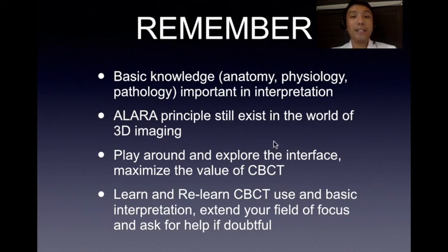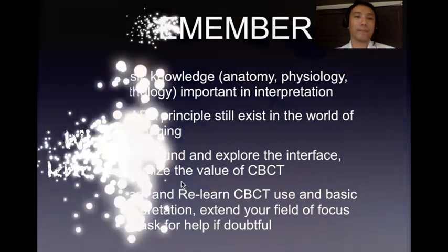One good thing about CBCT, since we have that interface, we try to play around with it. We have to learn, relearn its uses. It takes time for you to learn how to appreciate each individual slice. It doesn't come immediately or readily. Thankfully, since CBCTs are in programs that we could view, we could actually go over it even when we go home and we are not limited to our workplace.